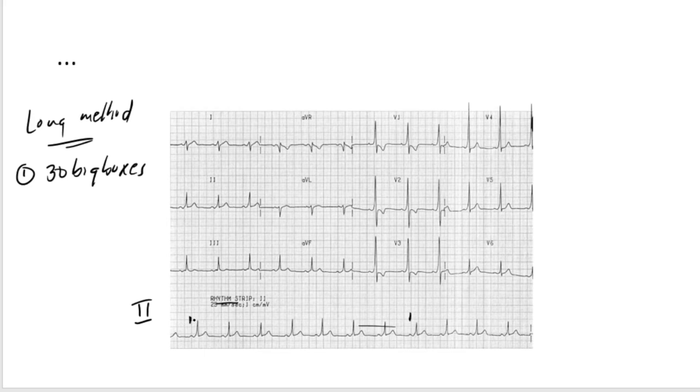So we want to start here at the beginning of the QRS complexes. So we start one, two, three, four, five, six, seven, eight, nine, ten, eleven, twelve. Up to here is 30. So we've counted 30 big boxes.